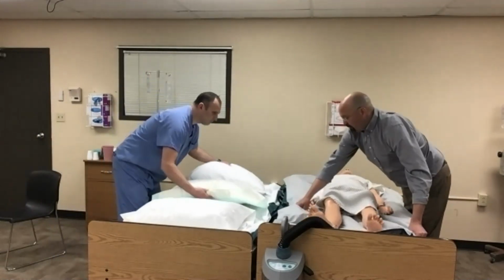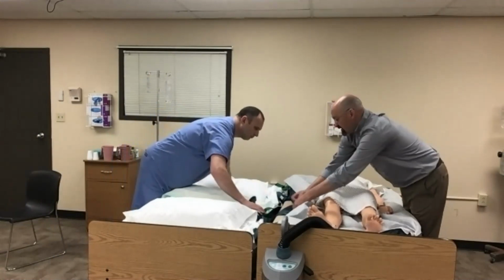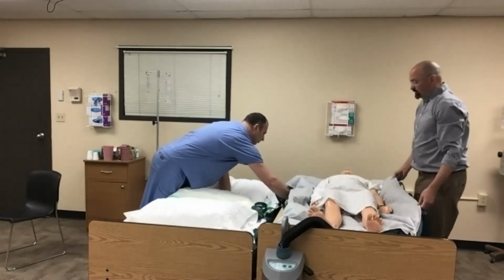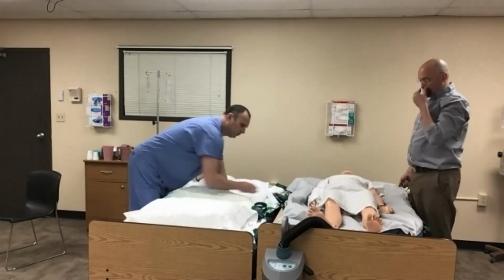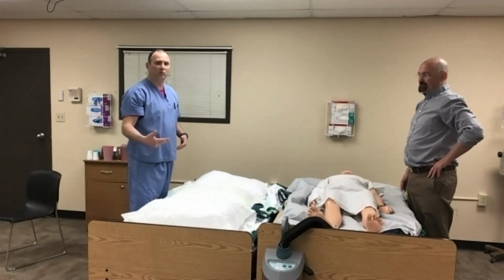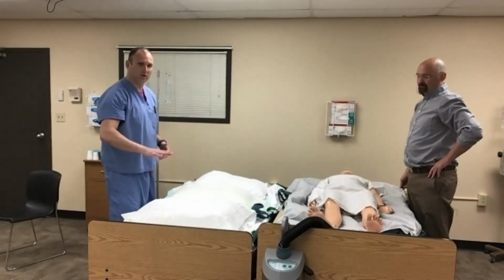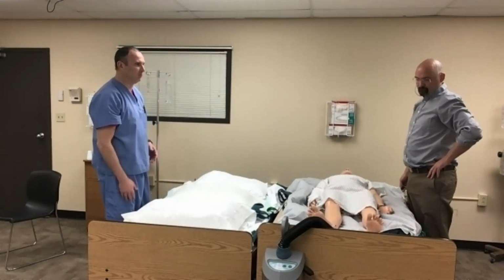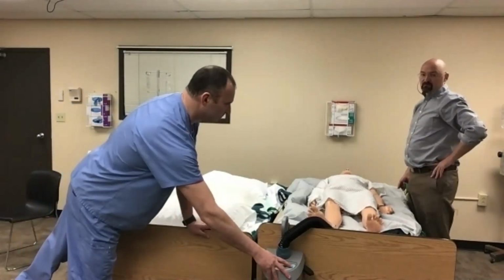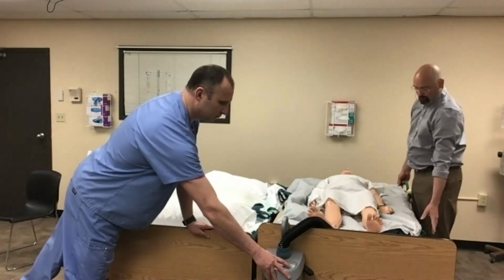So we're going to line them up here, where the tuck is under. I'm going to hold onto the mat. And understand also, these beds would be higher. We're obviously tall. These beds would be higher. They're a little older, so they're not going up as high as a normal hospital bed. Go ahead and turn it on for us. Ready, Chris? We're going to do the task first and then explain what we're doing.